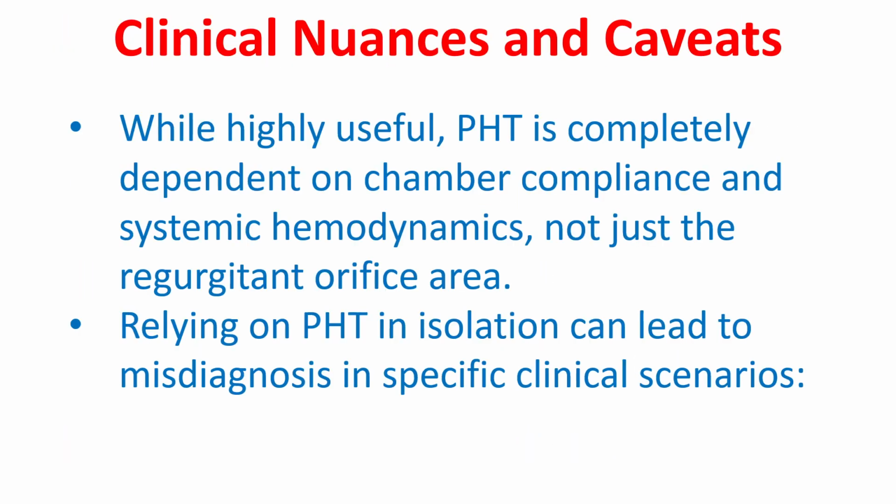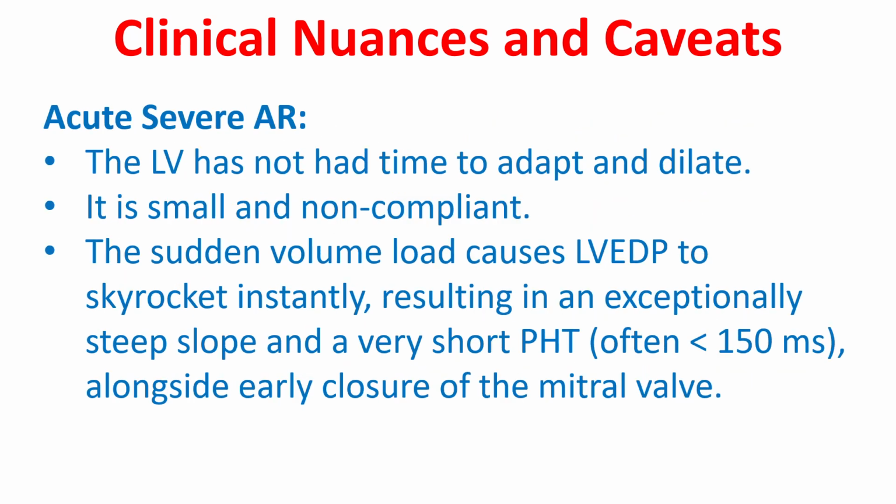While highly useful, PHT is completely dependent on chamber compliance and systemic hemodynamics, not just the regurgitant orifice area. Relying on PHT in isolation can lead to misdiagnosis in specific clinical scenarios. Acute severe AR: the LV has not had time to adapt and dilate.